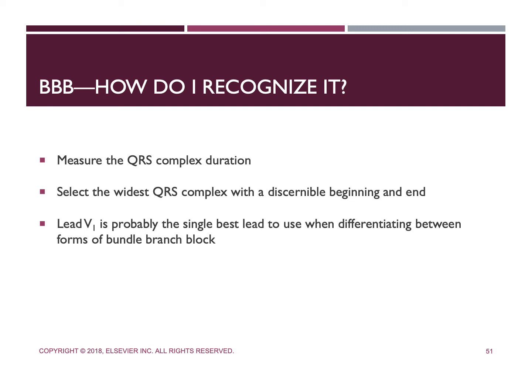Variation in QRS duration from lead to lead is often going to be seen and may even produce some confusion about whether the complex is wide or not. As a rule, we're going to use the widest QRS complex to determine the width. So what you want to try to do is pinpoint the exact beginning and end of that QRS complex. This can be a little bit difficult to do and is sometimes even impossible.